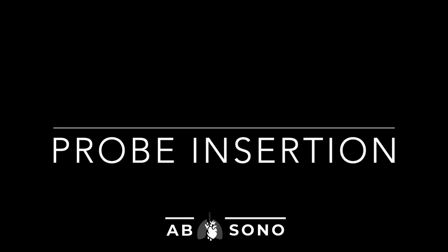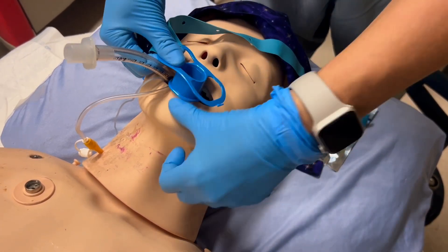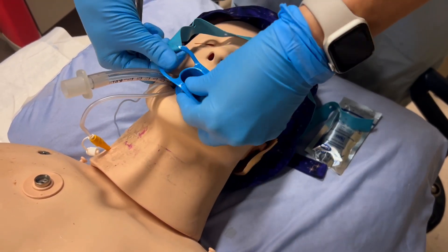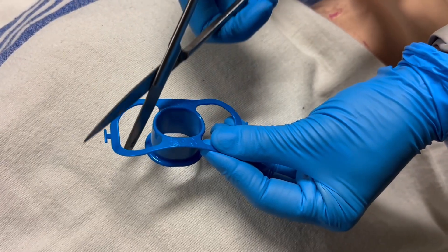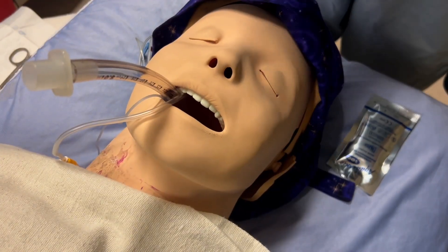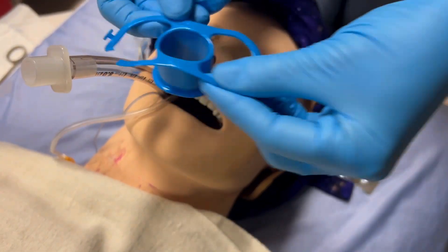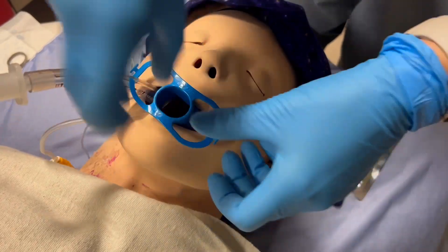We will now explain how to intubate the patient with the probe. The first step is to insert a bite block. The bite block was designed for non-intubated patients and will not fit over the endotracheal tube. You must alter this bite block by putting a slight cut in the side of it.